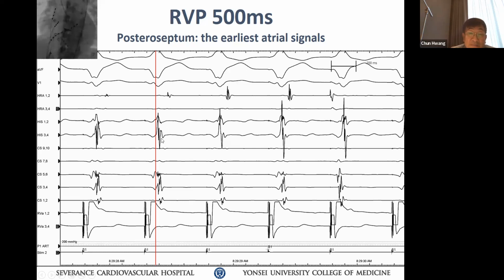Way back there. You have two different complexes going on here. There is a small sharp potential behind it, after the His QRS complex. Yeah, go back. Yeah, that one. That's your local A there. Because you're doing the V pacing, it is merging together. It's a fusion beat here. You're going to have a separation of a fully pre-excited pathway with the local A.